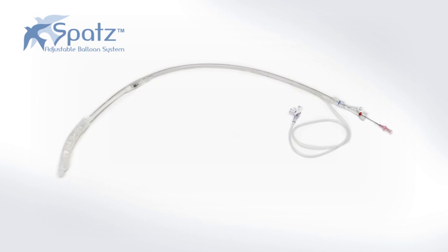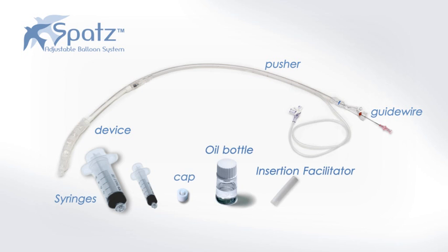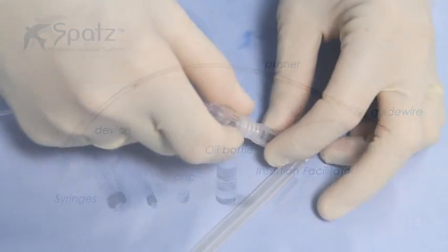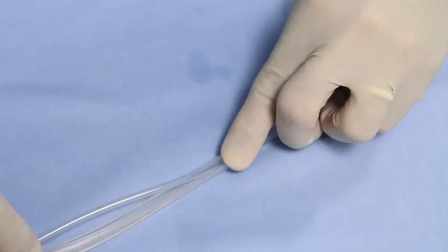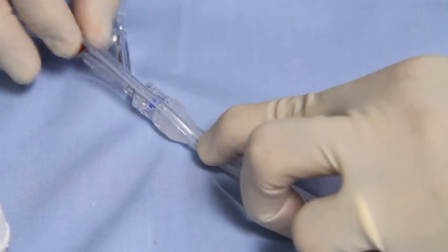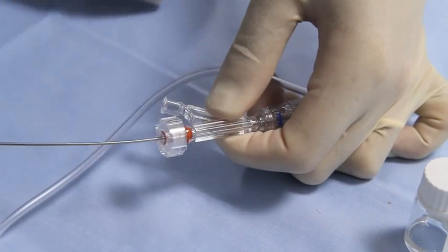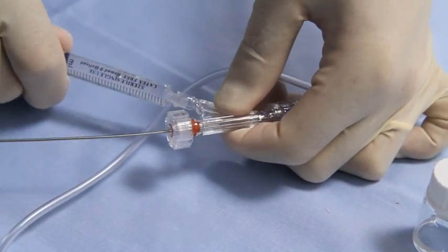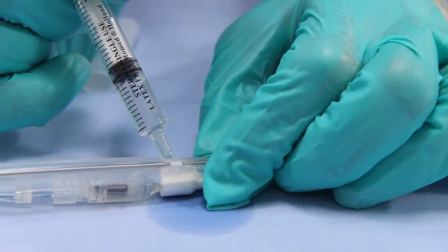The insertion assembly consists of a guide wire that passes through a pushing catheter and the device, two syringes, a cap, mineral oil, and the insertion facilitator. The extension tube connection should be in the closed position clockwise. The extension tube is inserted into the groove of the pusher. Assure the wheel is in the closed position. Lubricate the lumen with the provided oil and add a drop of oil in four places as shown.